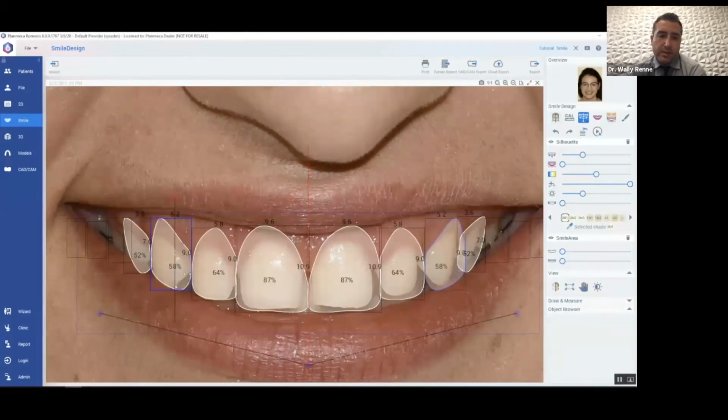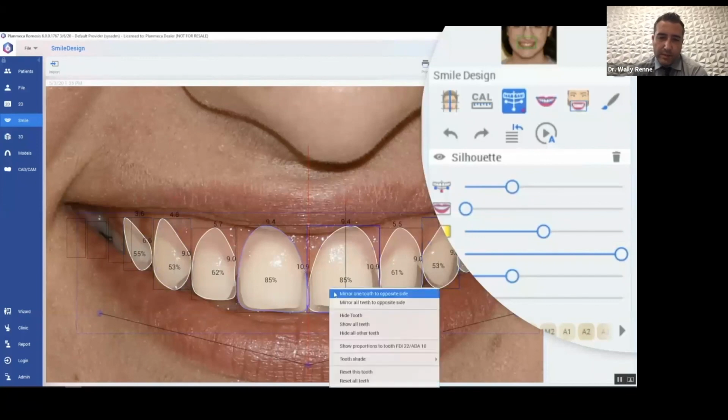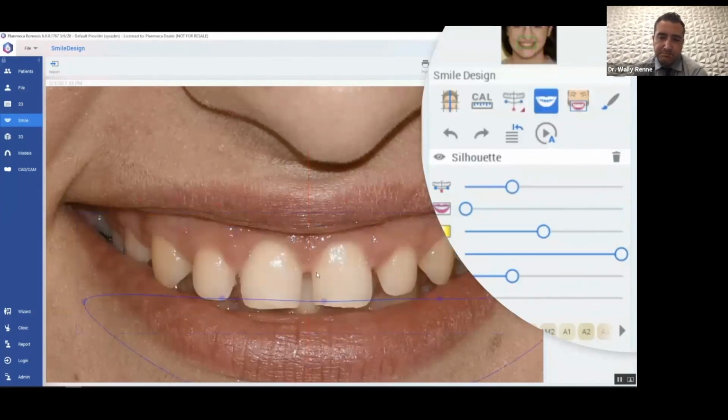Okay, so now here we are, manipulating those silhouettes. A little bit sped up here for you guys because I don't want to run out of time. I want to show you everything that I want to show you today. And barely touching the wet dry line of the lower lip. Try not to lengthen too much incisally. Lengthening on the laterals a decent amount there.